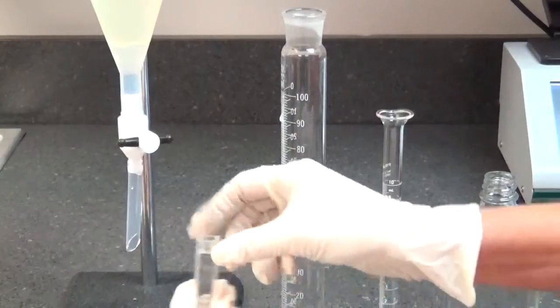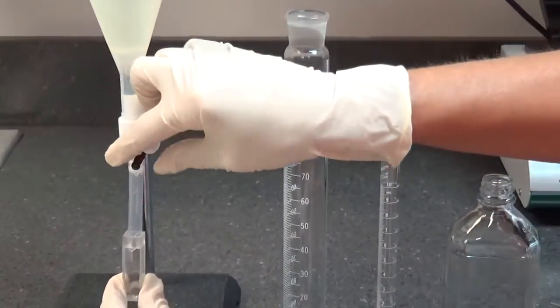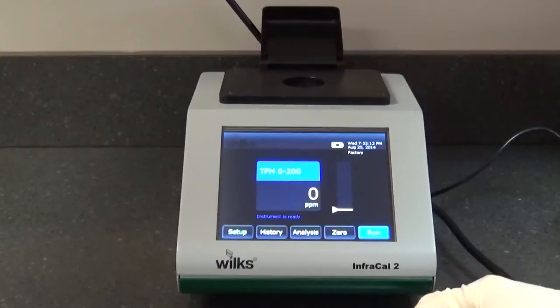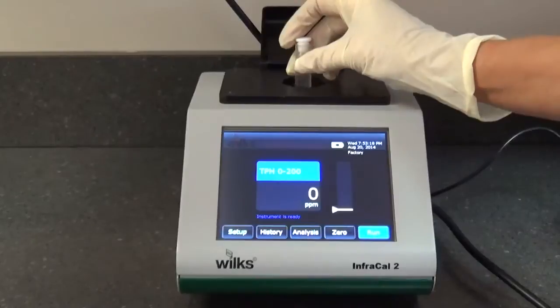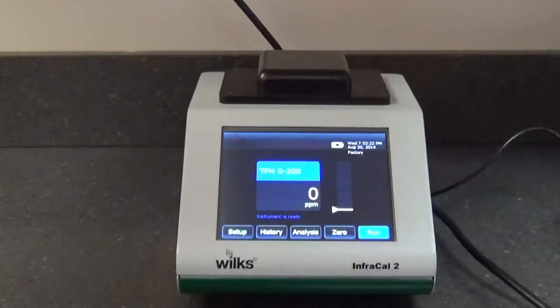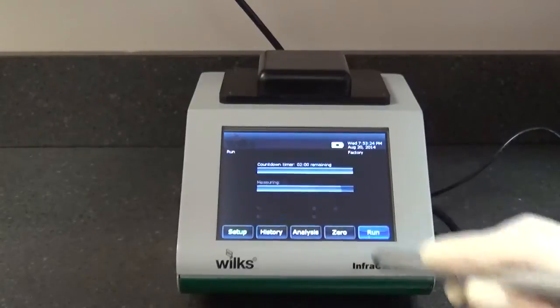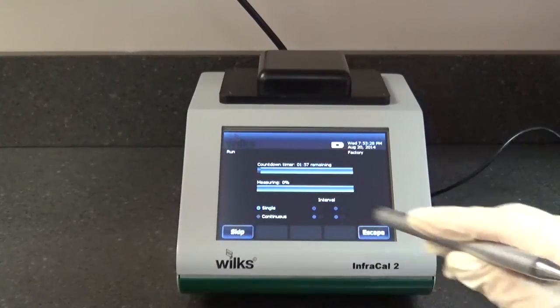Fill the cuvette with solvent extract. Place the cuvette into the holder on the InfraCal 2 analyzer with the frosted side facing front. Close the cover and select run. After the countdown timer and the measurement time, the result will be displayed.